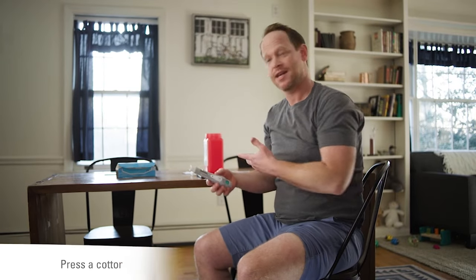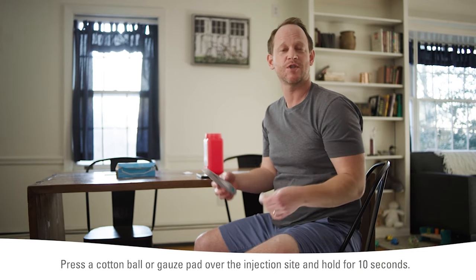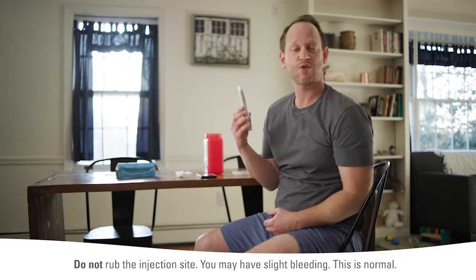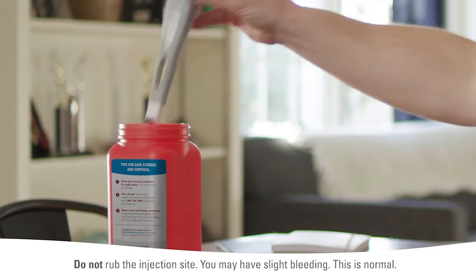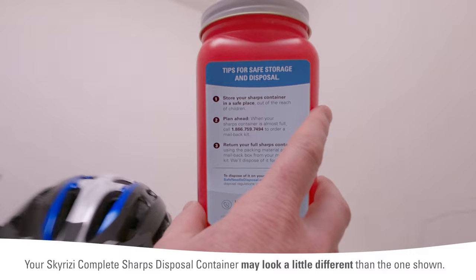And that's it. Now, I press a cotton ball where I injected. You could also use a gauze pad. And I drop my used pen in one of these sharps disposal containers — safe and sound and also out of reach. Another injection complete.